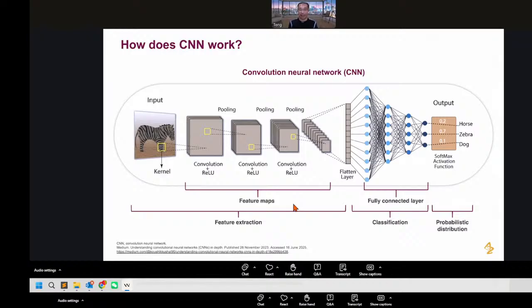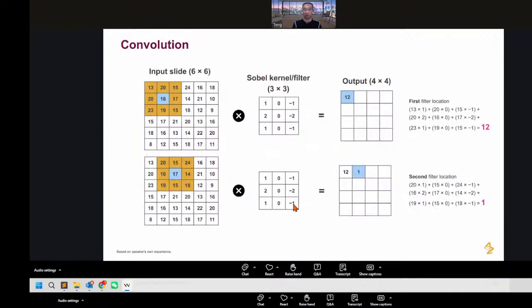But going back to CNN, this is the most mature model because it started early. It's a fully trained and fully supervised model. So how does CNN work? It uses a convolution layer and a pooling layer, step by step. I think the next slide will explain it slightly better.